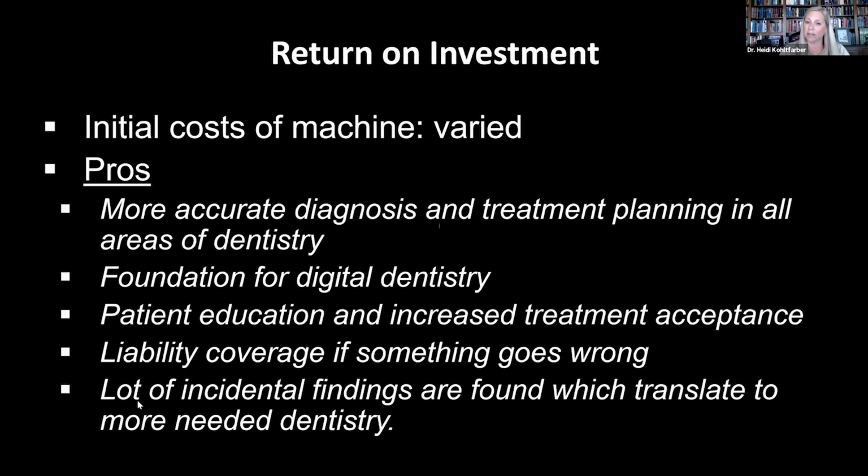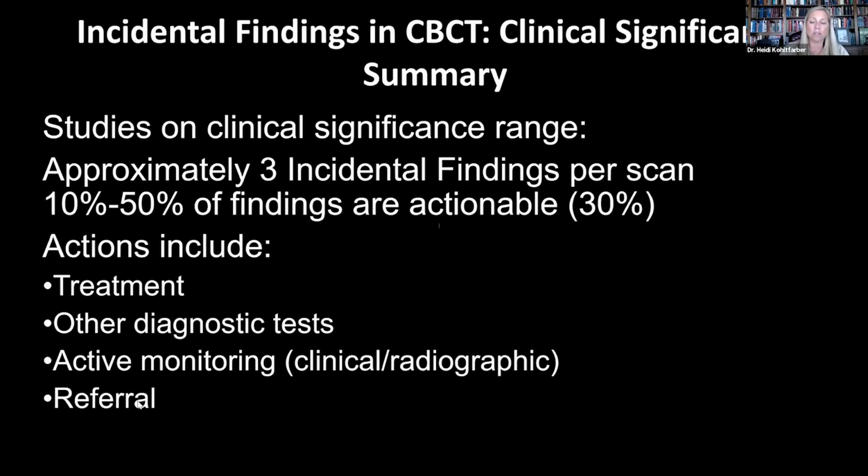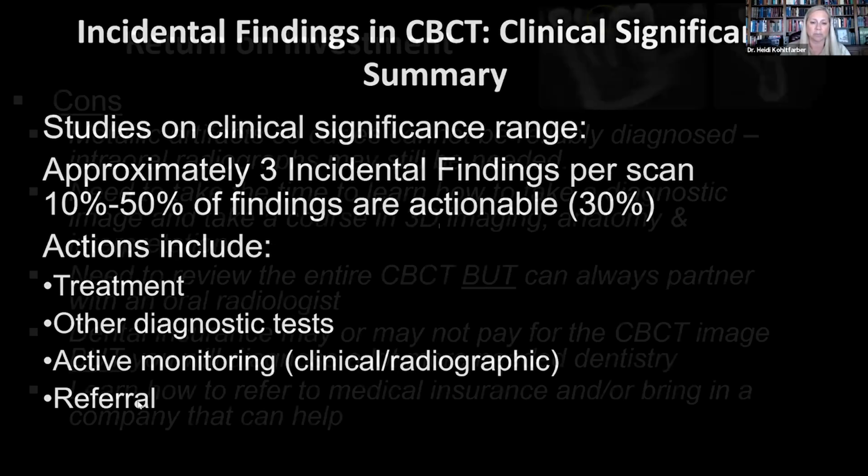We see a lot of incidental findings, and that translates to more needed dentistry for the patient. And right there, you've got a nice return on investment as well. We're looking at the research of incidental findings. The research shows between 10 to 50% of findings that we do see are actionable. We do see at least 3 incidental findings per CBCT. That's very common, maybe 3 to 4. And our actions might be additional treatments, other diagnostic tests, active monitoring, or referring on to an additional specialist.